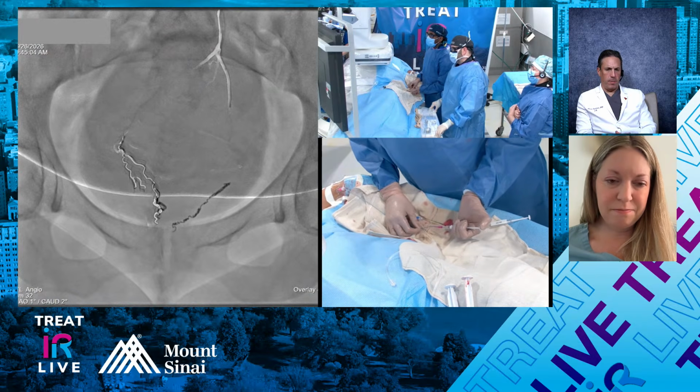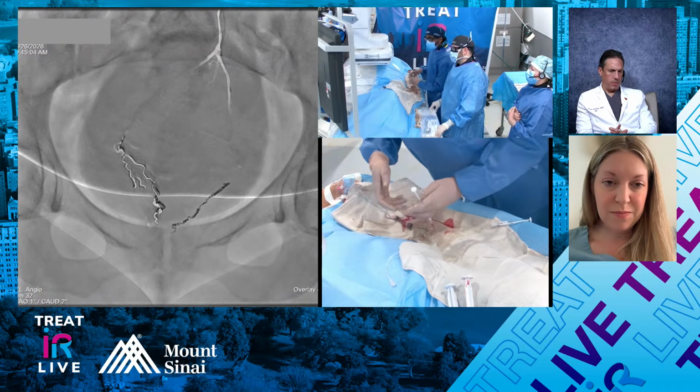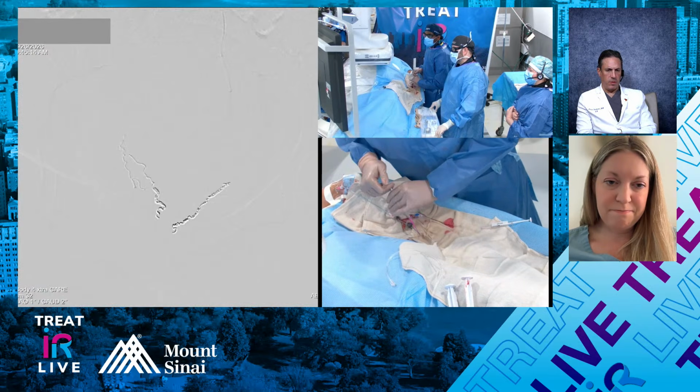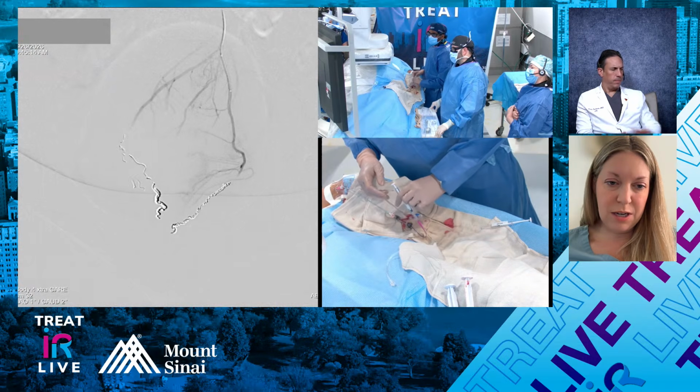We actually see that quite a bit in patients when we coil the rectal artery during prostate embolization. They get that, maybe not to the same degree that we would see here, but absolutely, it's something that you just really have to treat symptomatically. That result looks good, guys.